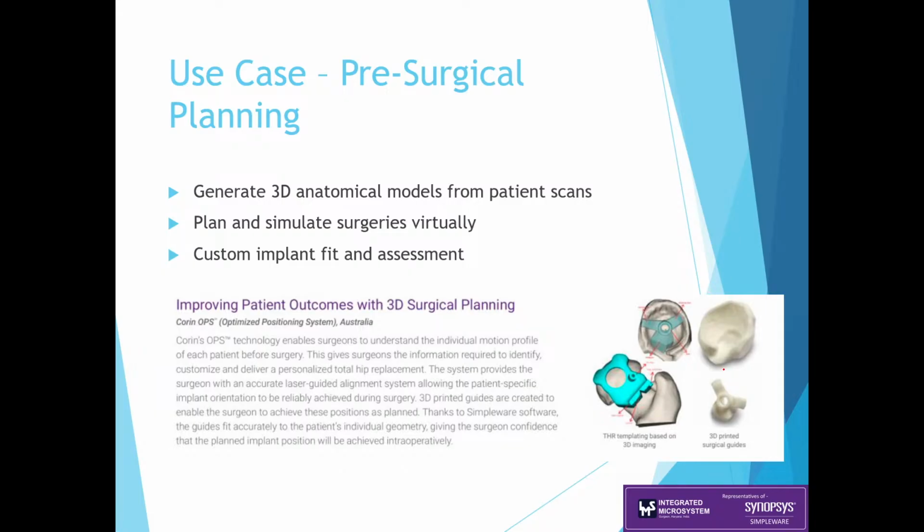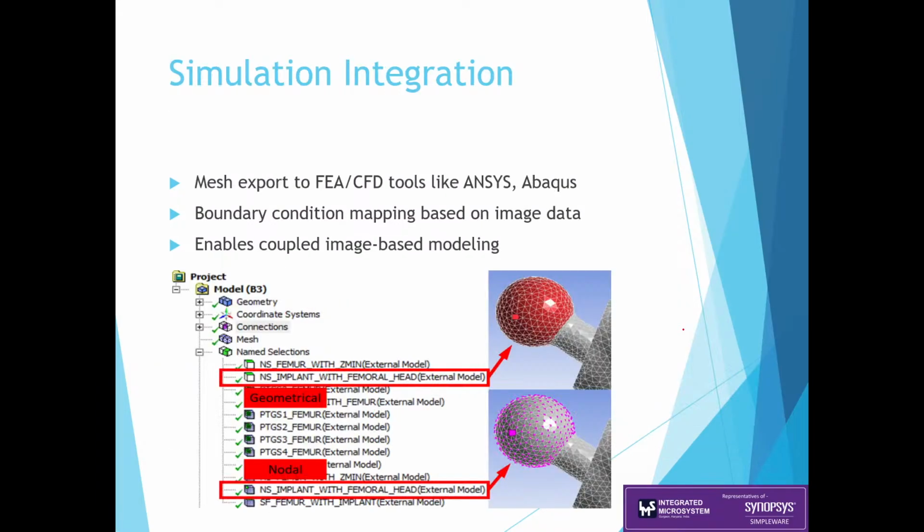Then if we need to check the fit of custom implants over the anatomical data before the final surgery is performed, that too can be carried out, or we can directly bring in the STL file of the implant, and once it has been brought in, we can do the implant positioning in Simpleware. Once the positioning has been completed, we can have the best fit outcome for any dataset, and it's proven in various publications that have used the same approach.